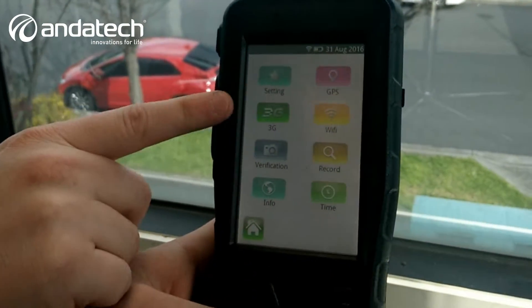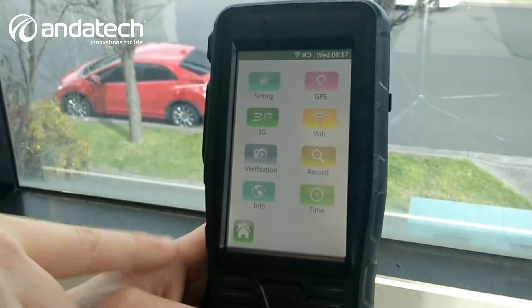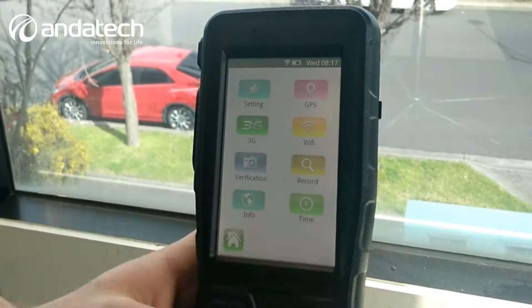Functions that are available: you have 3G, GPS, Wi-Fi. You can check all your records, set the time, and check the information of the device. Once again, full of features.